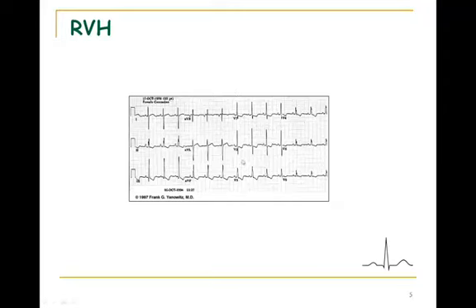We never get ideal. It's very difficult for me to find ideal EKGs, but this is kind of unusual in that you see an R wave in V1 and V2. Normally you would see an S wave. I was trying to find you a good one. It was very difficult for me to find one where you also saw the S wave in V5 or V6. But this one, no. It was difficult for me to find it for you.